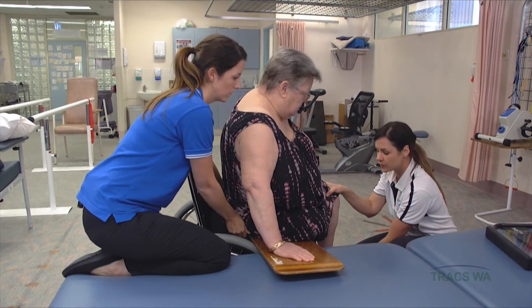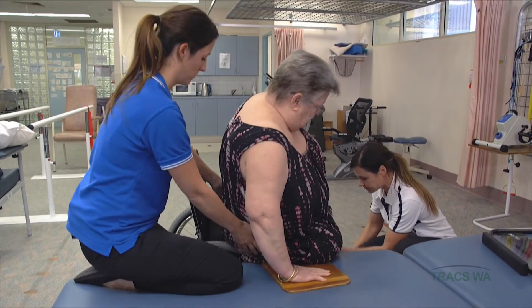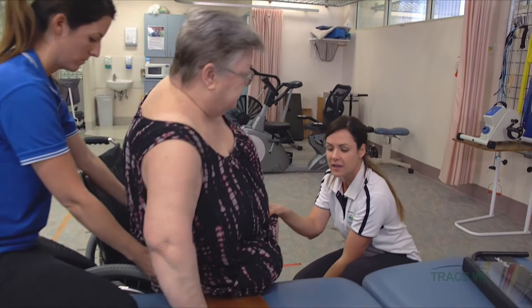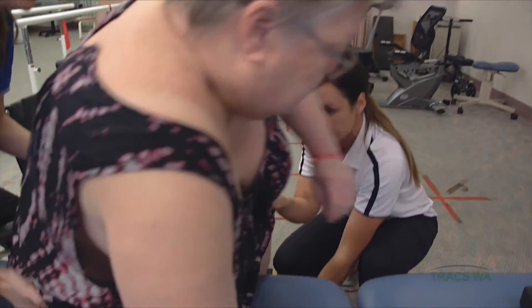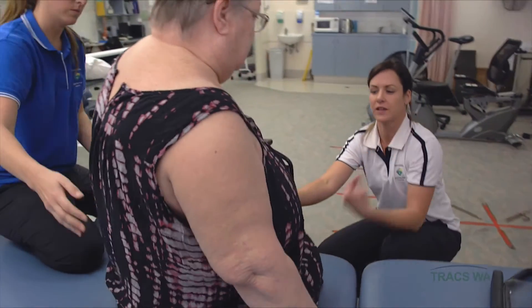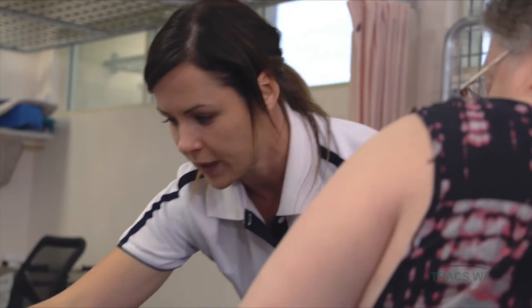When you're ready: one, two, three, go. I'll reposition this foot again. And again — I'm going to come more across over this side. And then just straighten yourself up. Lean over to the side and take that slide board away.